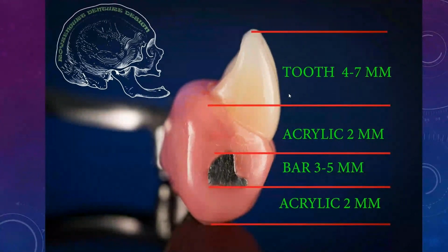Remembering how much space certain things take is very important when it comes to fabricating implant supported restorations. And most of you guys have seen this picture. I've posted this a few times, and I've used it in my lectures a few times. But to me, this picture never gets old because there's a certain amount of room that's needed for the materials to be fracture resistant. In most cases, when it comes to bars, you want your bars to be 3 to 5 millimeters tall.